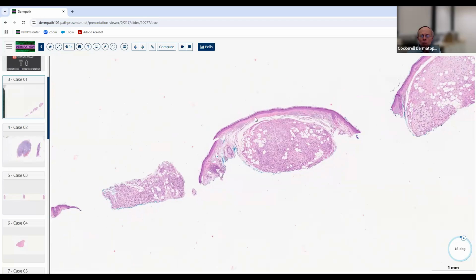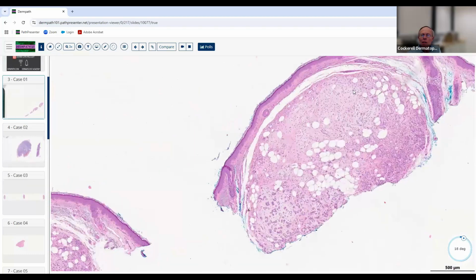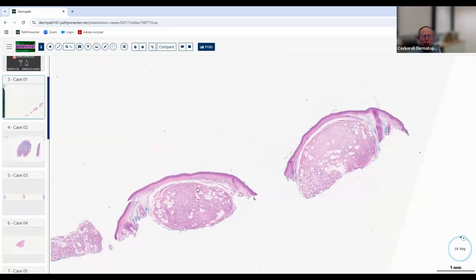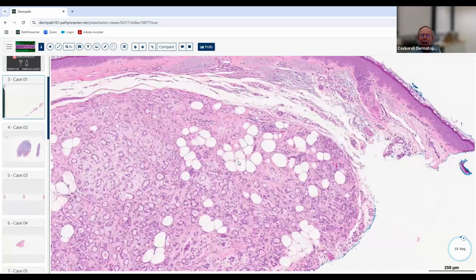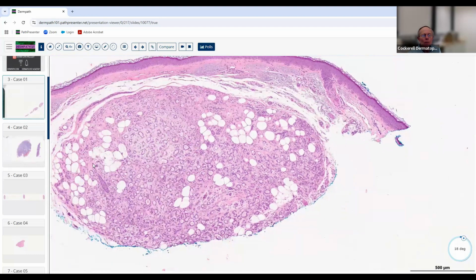It's very, very small. It's well circumscribed. It's got all those features that we've talked about many times before. On this side, you see another area of the same lesion over here. And at low power, it's kind of hard to say whether it's epithelial or non-epithelial. It's got this interesting little finding here, which we see a lot of times in things like nevi. Sometimes you just do shave biopsies or punch biopsies, maybe for an inflammatory process, and you'll see what looks like fat way up high in the lesion. And it's been a puzzle to dermatopathologists for many years as to why that happens and even what it is.